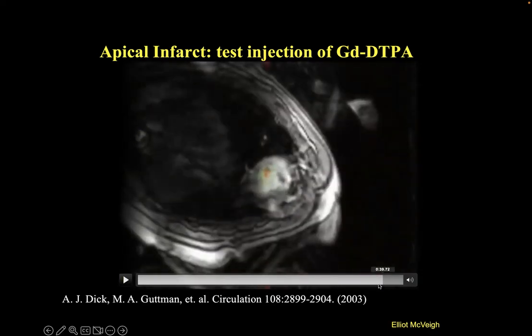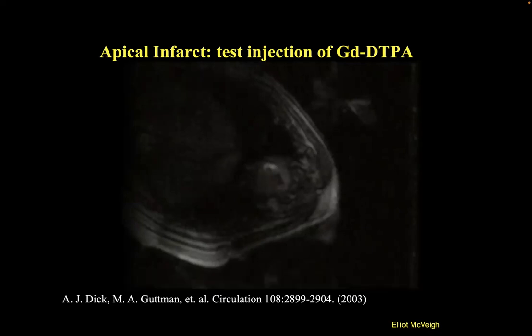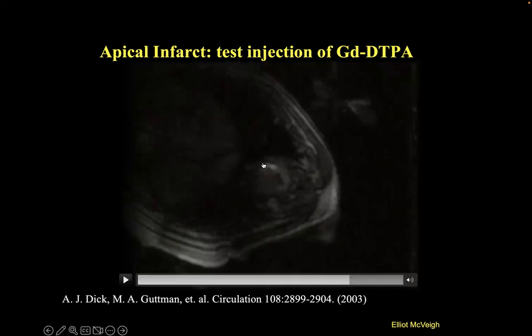You can change the angles in real time to see where the tip of the catheter is, and there's where the injectate goes. Not a simple problem, actually. You kind of take it for granted, like when you get an inoculation or penicillin in a muscle, and they just stick it in. Ask yourself: where does that stuff go? You can see in real time where it goes. It forms a little pocket of material and then diffuses out from there.